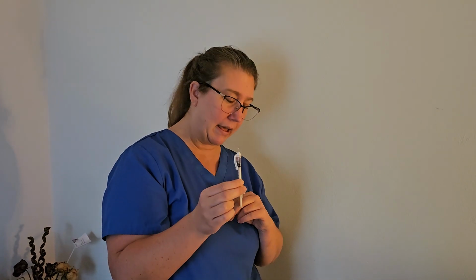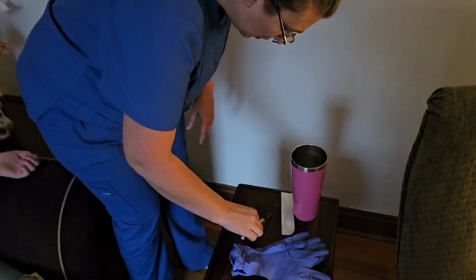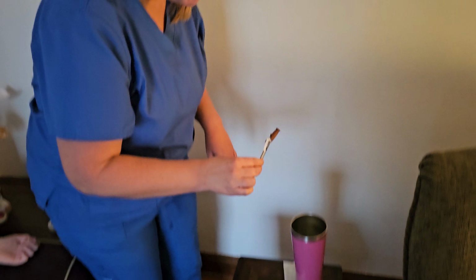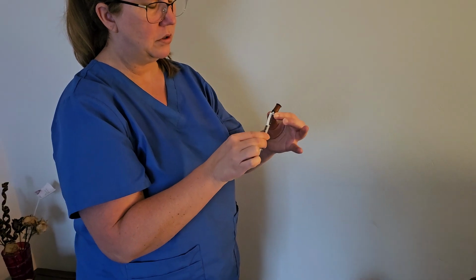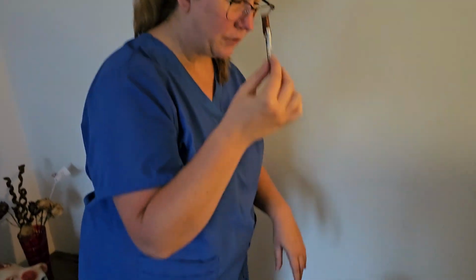So what we're going to do is recap this. How we do that is we locate our cap, which is still sitting on our table, and we use the scoop method. So we scoop the cap, and very carefully put it back on.